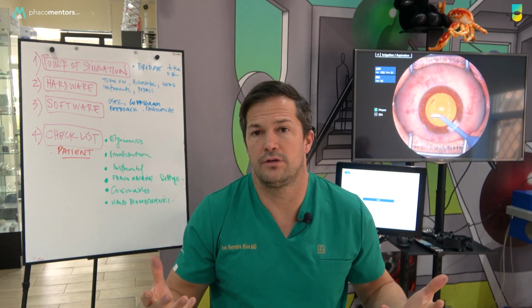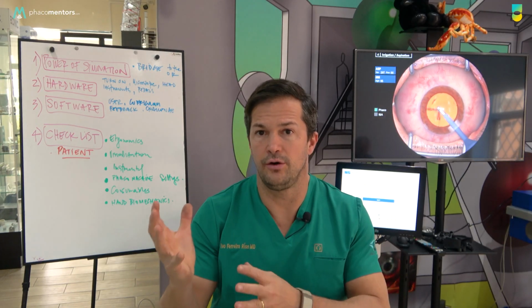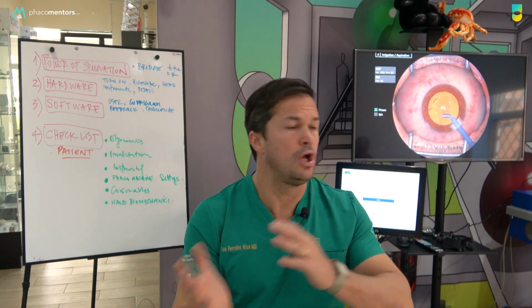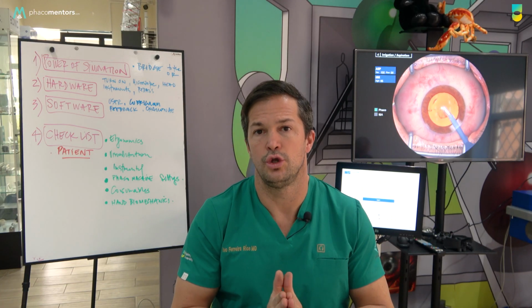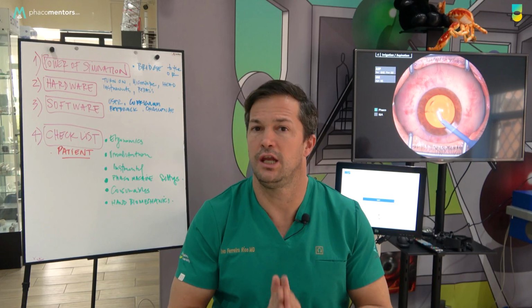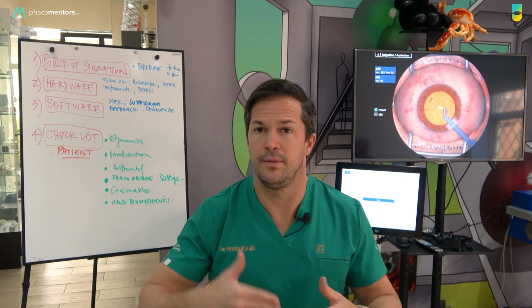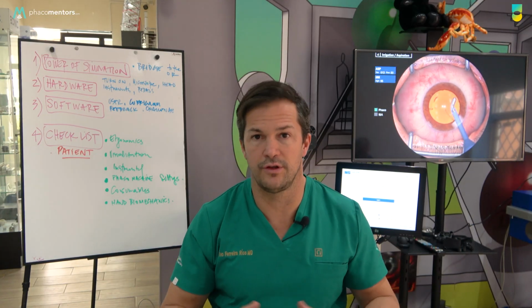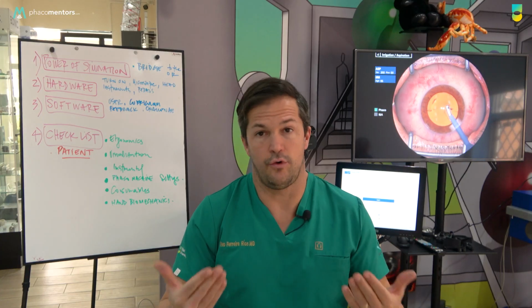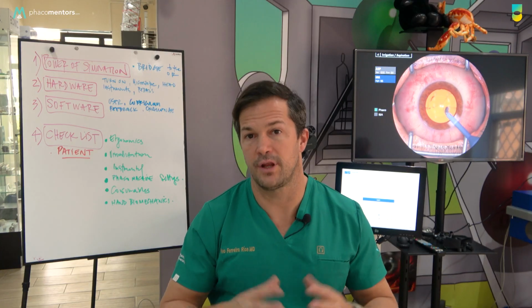And the first thing we need to talk about is simulation. Simulation is the bridge from theory, what you need to know and knowledge, to the operating room. Actually, I will say that simulation should be present at any stage in any operating room around the world, and you should be like an airplane pilot, simulating it all the time. Simulation mandatory 2 or 3 times a year for those things you don't do very frequently. And of course, with people who want to learn new techniques and new things, simulation is the place to do it.